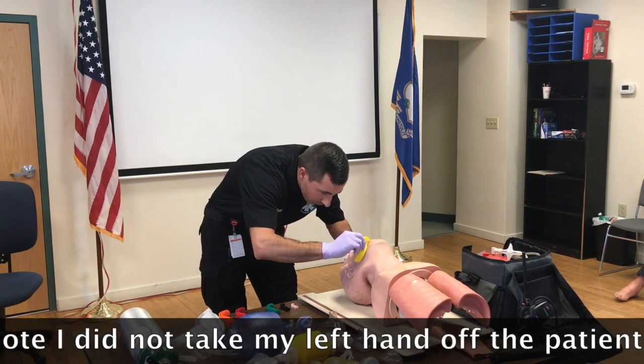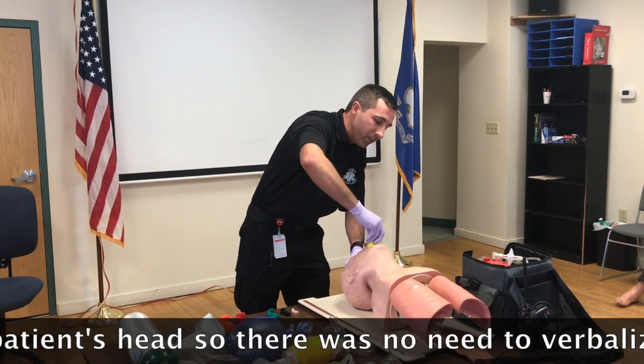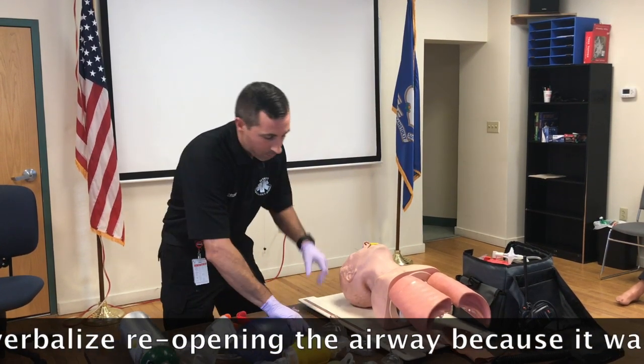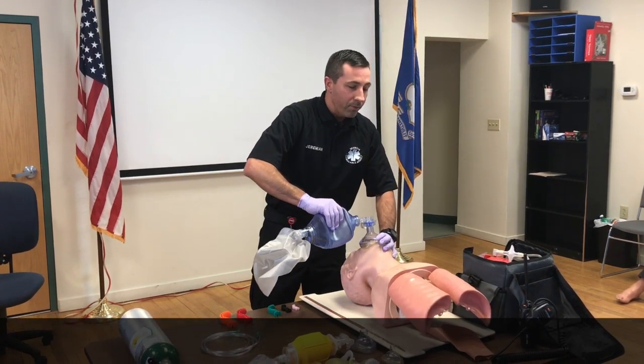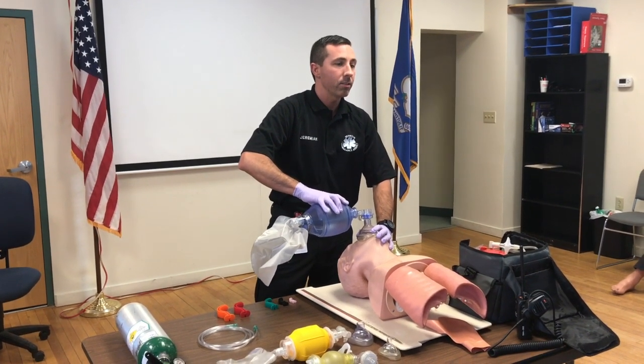Now I'm going to measure appropriate size OPA, the corner of the mouth to the tip of the ear, inserting tip up, rotating 180 degrees. No gag reflex is present, and the patient accepts the airway adjunct. Reopening my airway. I'm going to get my first breath in. I'm going to ventilate my patient one breath every 5 to 6 seconds for a full minute.